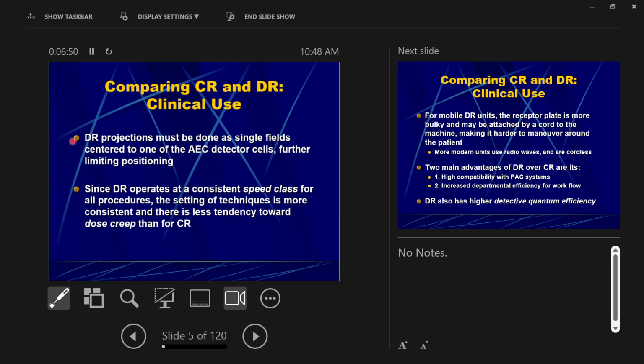Lewis, like a finger, you have the AP, lateral, oblique, all on one plate, and you did it with three exposures, and you only brought the receptor to the processor one time. What's another advantage? The other advantage is in the same vein: when the image is displayed, the physician doesn't have to toggle between images to see all three at one time.